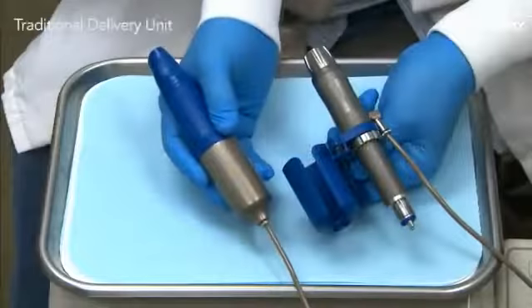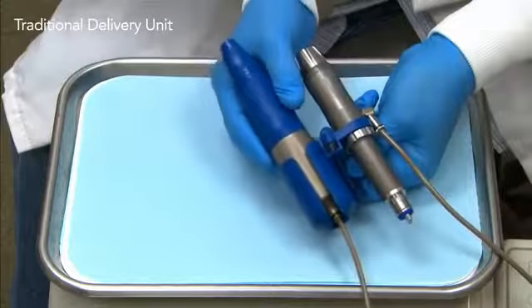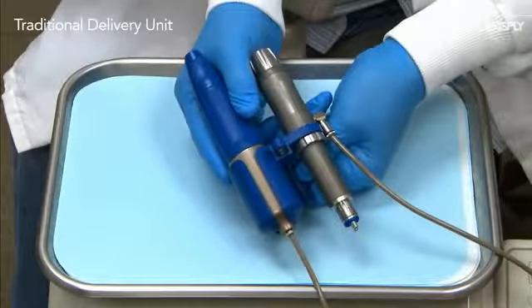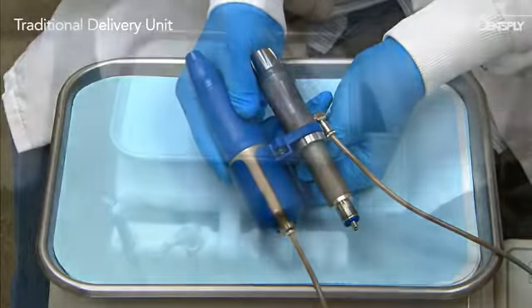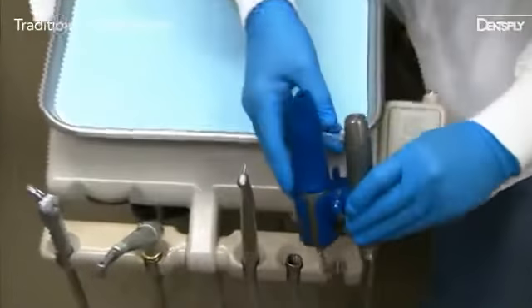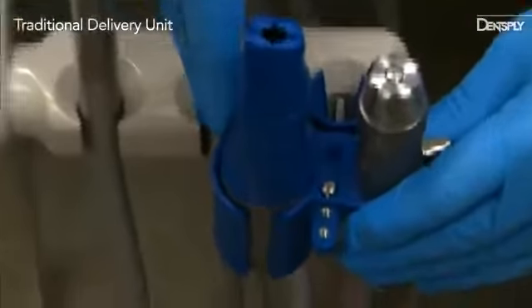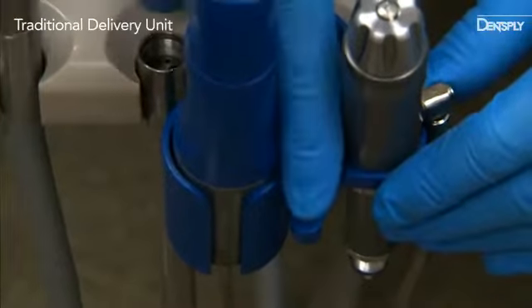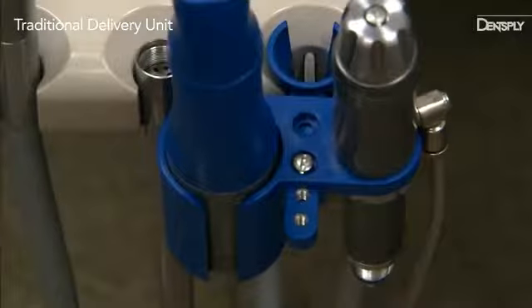First, place the DigitPower Dispenser in the adapter with the dispensing end up. The air delivery tube should fit through the front slot and exit the bottom. Next, test fit the adapter on the dental delivery unit. If necessary, adjust the arm length on the adapter to fit the tool holder by removing the screw and selecting the proper alignment hole.